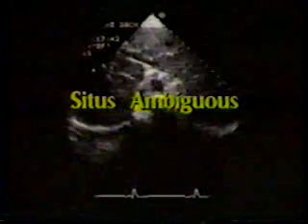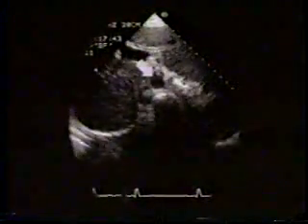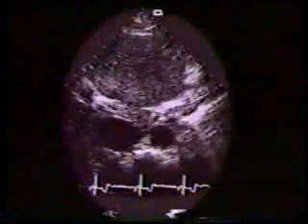In this example of a 22-year-old female with situs ambiguous and dextrocardia, note liver is in the midline with bilateral extensions. Aorta is also in the midline. Here is inferior vena cava, which is quite posteriorly located. Stomach can be readily identified because its contents are highly refractile due to admixture illustrated in this real-time example.